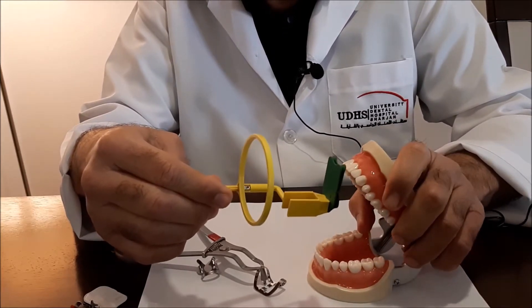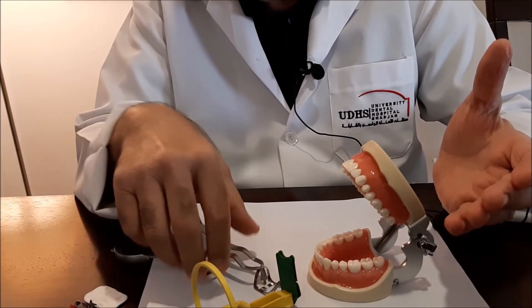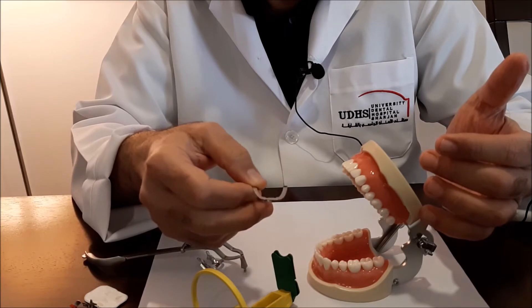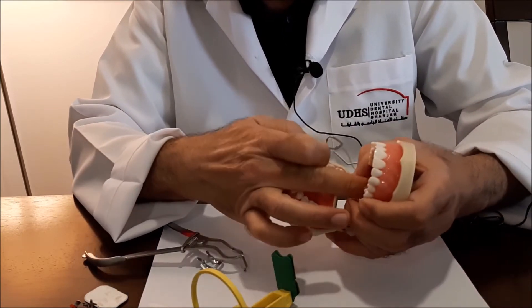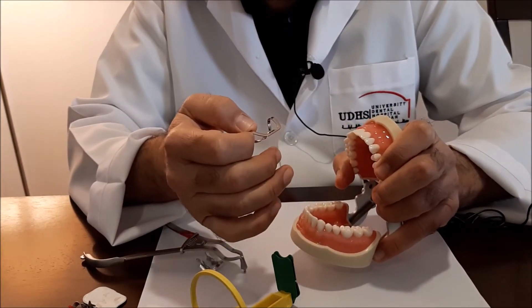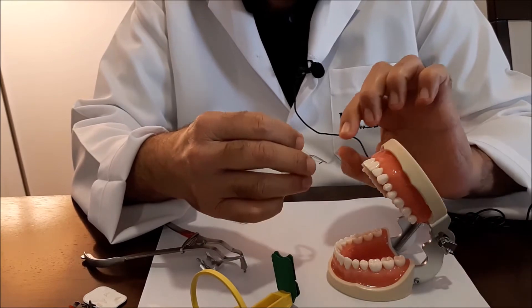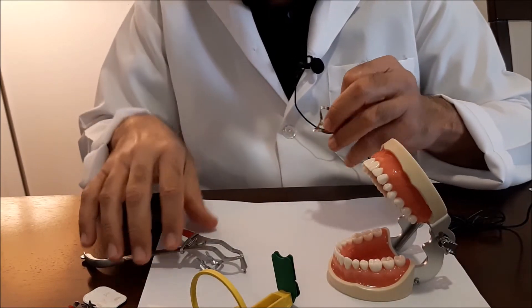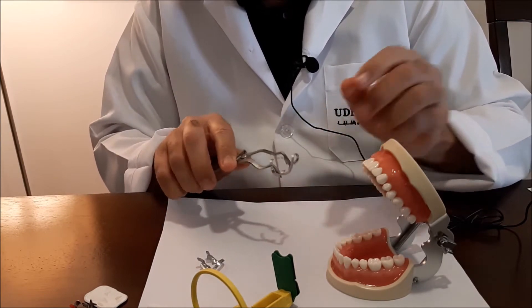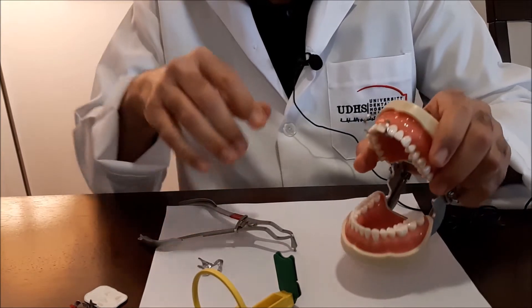With the upper anterior teeth, we encounter the same common problems. The clamp interferes with the placement of the sensor and sensor holder, and the palate always causes the apex to be cut off from the image. To avoid this, here are some tips that will help us in the placement of the sensor.